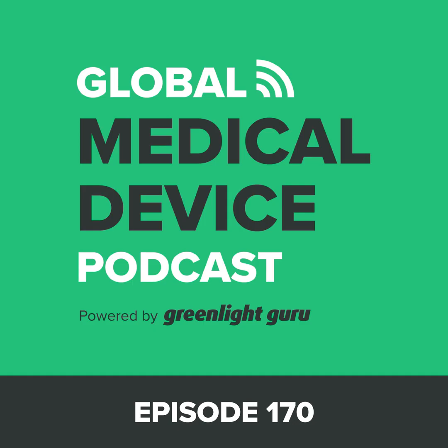I think it's okay for it to be very high level in this initial conversation with FDA. You don't have to have your software broken down into individual unit testing modules and all of that. I think this should be a diagram of how does information flow through the device, what are the different logic engines that are associated with your device, whether it's machine learning or traditional logic gates, or however your software is designed. And I guess what are the different inputs that end up providing that intended use?